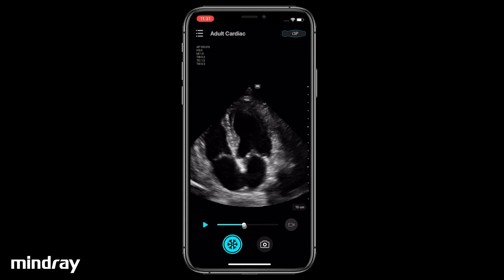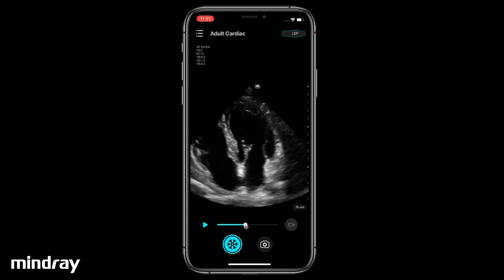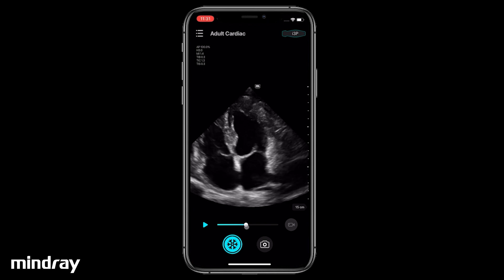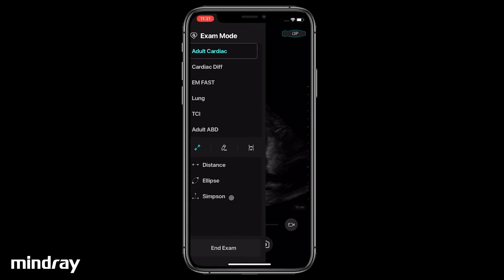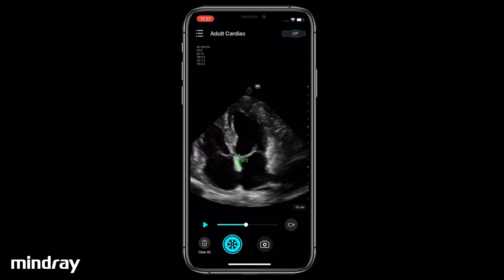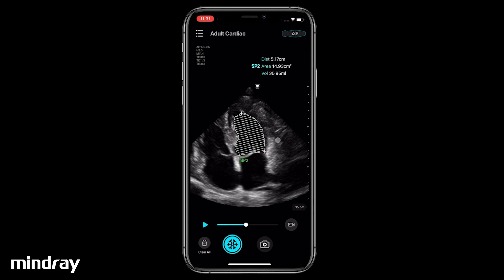Next, drag the progress bar to locate the frame showing the end systole. Tap Simpson again. Drag the first cursor to the mitral annulus septal. Drag the second cursor to the mitral annulus lateral. Adjust the third cursor at the apex if necessary. Adjust the trace line along the endocardium if necessary. Tap outside of the trace area for the results.